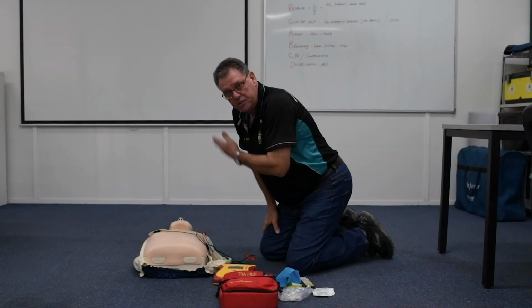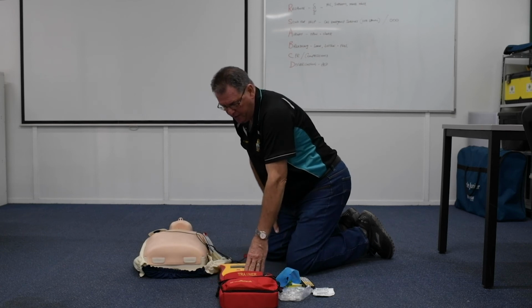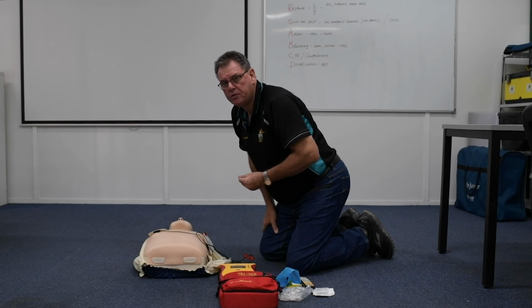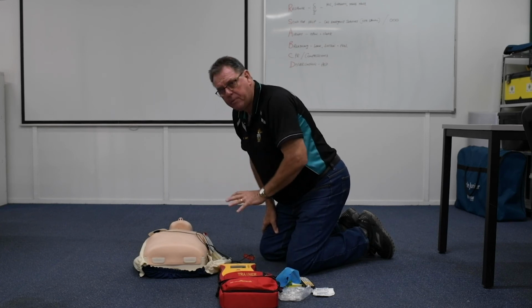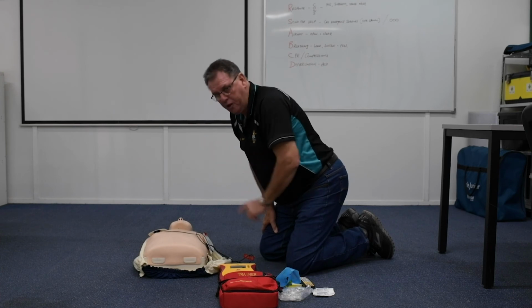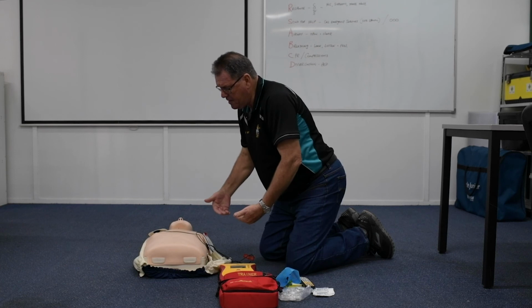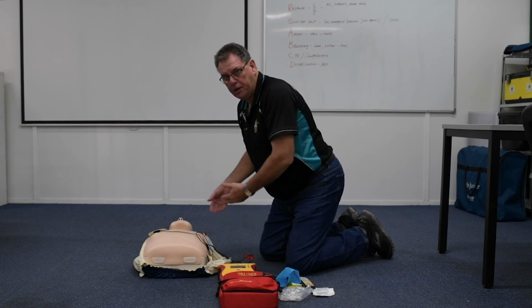So I've just taken you through a normal cycle for the AED. So this will now take us through 2 minutes of CPR. And once that 2 minutes is up, it will then reanalyse. So if we take it now that the AED has reanalysed and it says no shock advised, check patient.